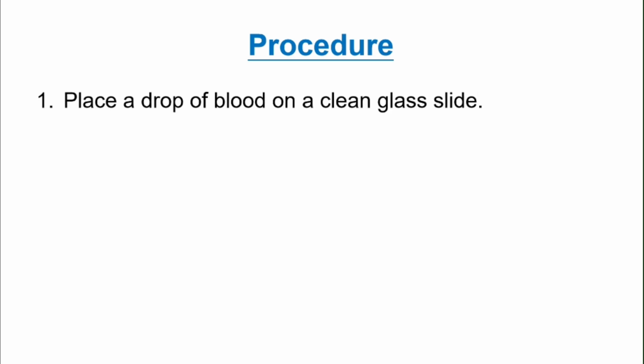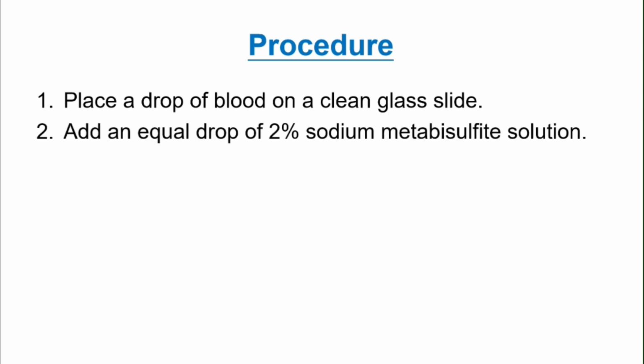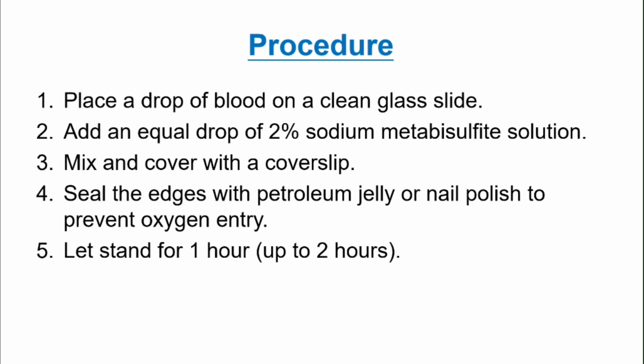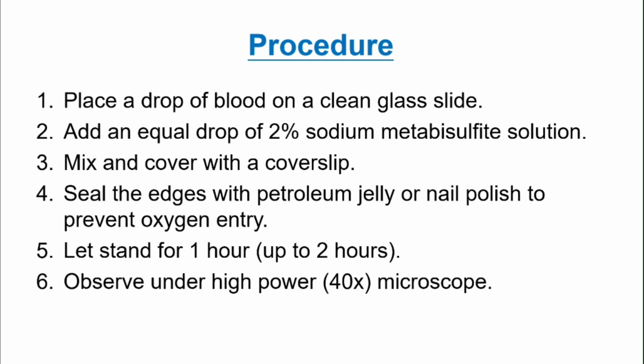Now let us go with the procedure. Place a drop of blood, as I said before, on a clean glass slide. Add an equivalent drop of 2% metabisulfite solution. Mix and add a cover slip. Then seal the edges with petroleum jelly so that oxygen is prevented entry, and we have to make it stand for 1 to 2 hours. Then we have to observe under a 40x microscope.